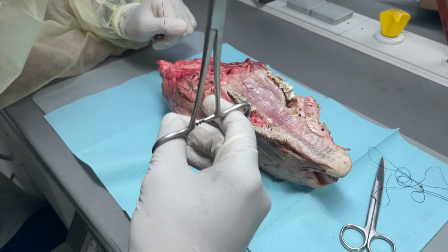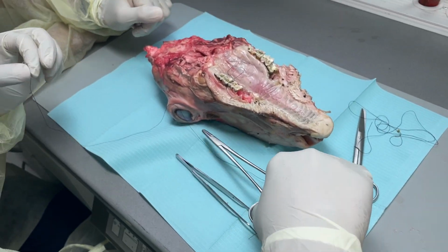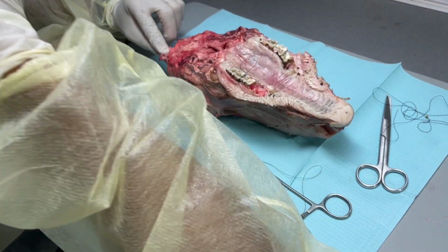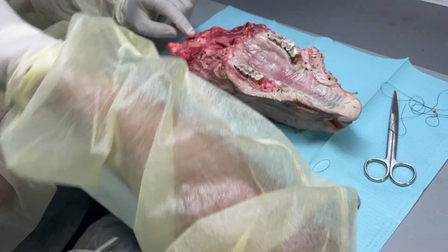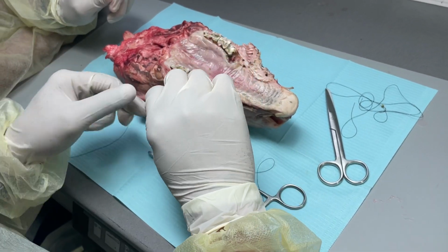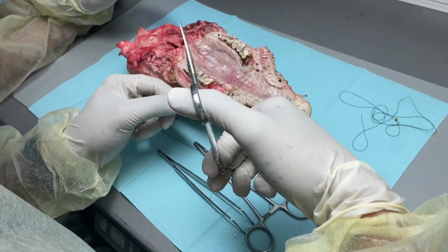So this was the simple one. Two clockwise, then one anti-clockwise, one more clockwise. Clear? Let us remove this now.